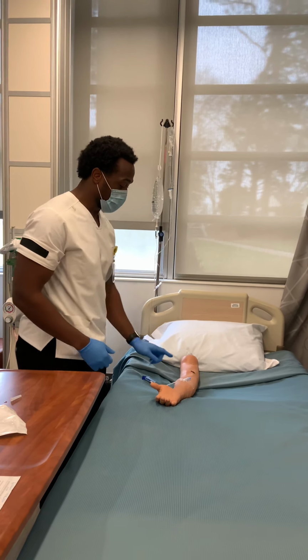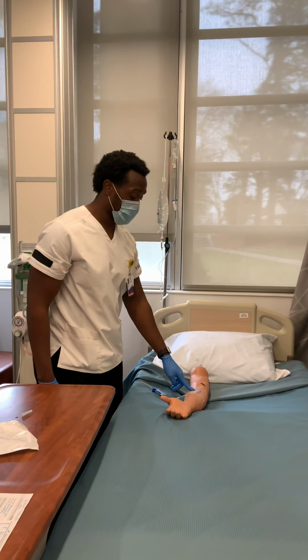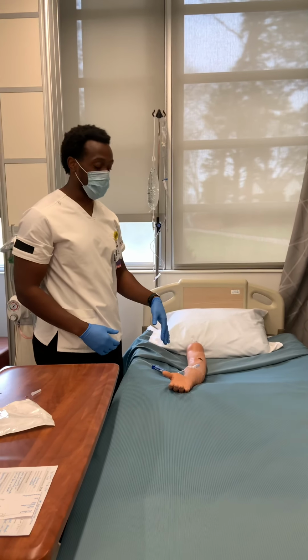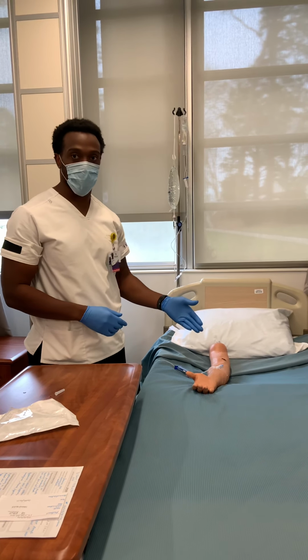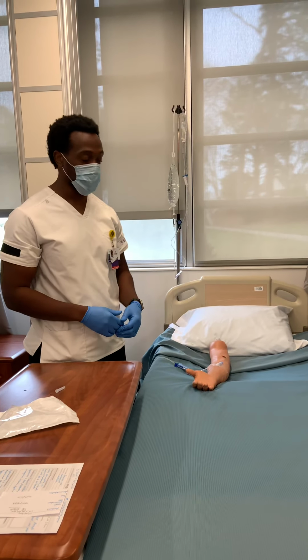And then you would assess the site of the IV or the INT lock for redness, swelling, or any adverse effects. You would teach the patient to notify the provider if there are any worsened symptoms and to make sure they complete all of their antibiotic medication.